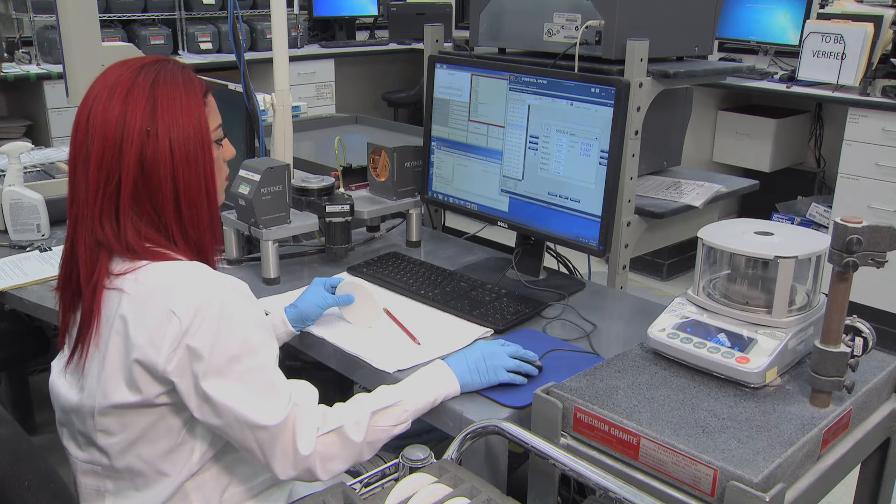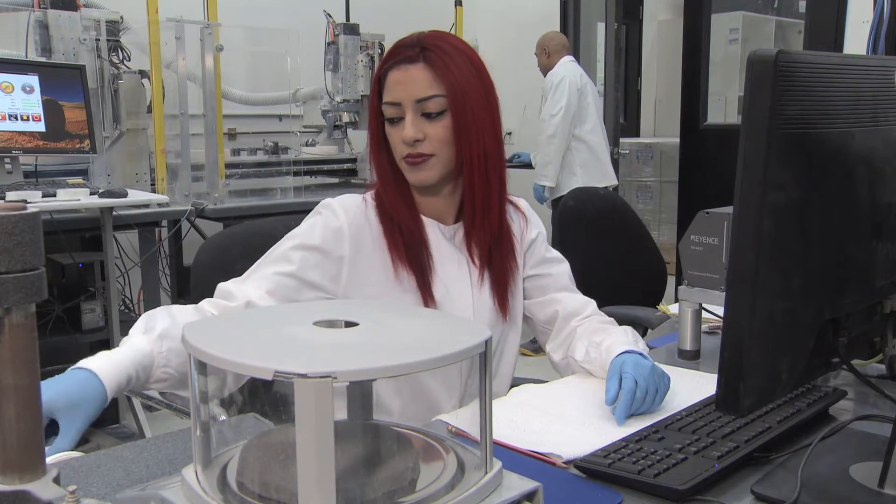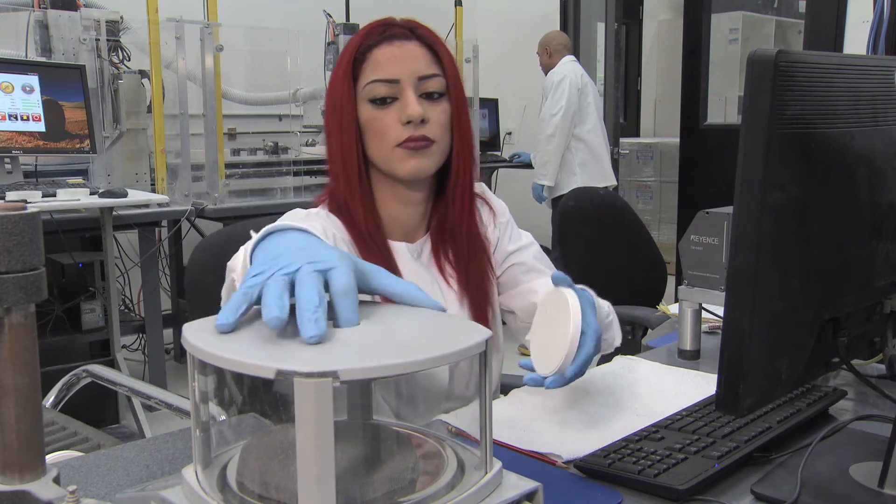It is worthwhile to note that many manufacturers compromise accuracy to reduce costs by sampling only a portion of the production, and skip the exhaustive 100% inspection that is performed at Glidewell.